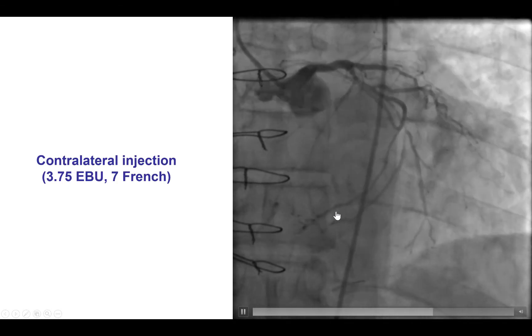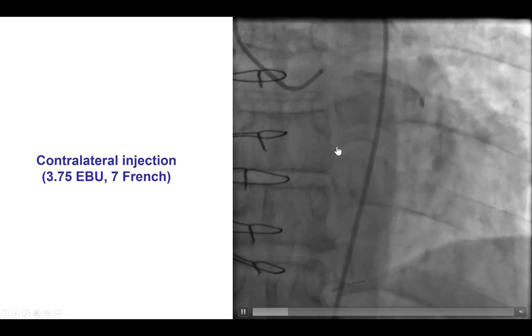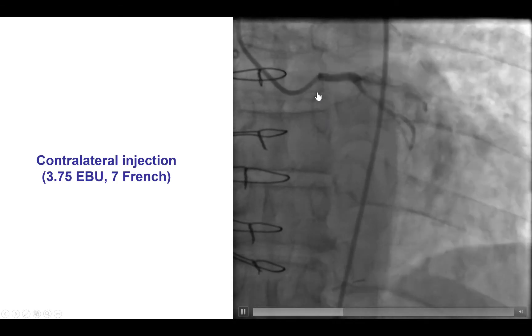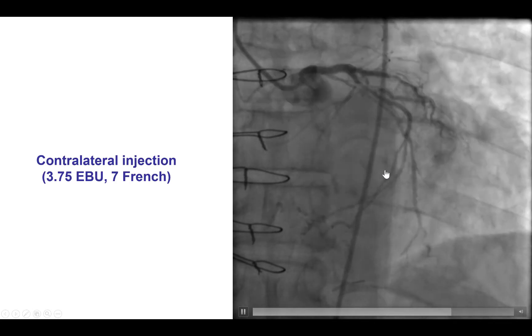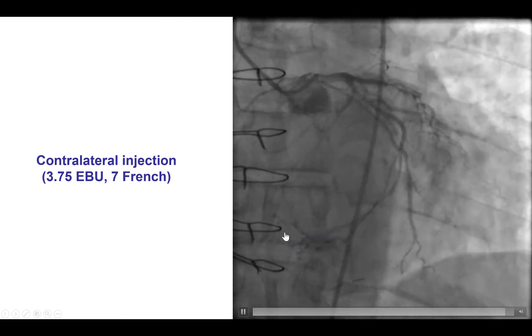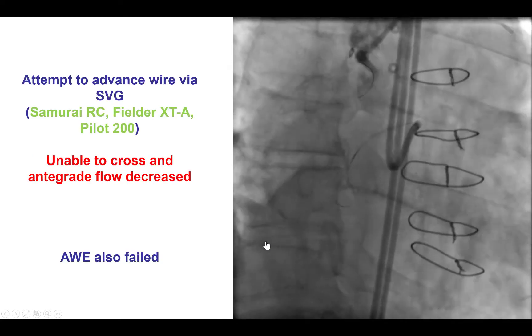This is the injection from the left, and that demonstrates the presence of epicardial collaterals going towards the distal right coronary artery.